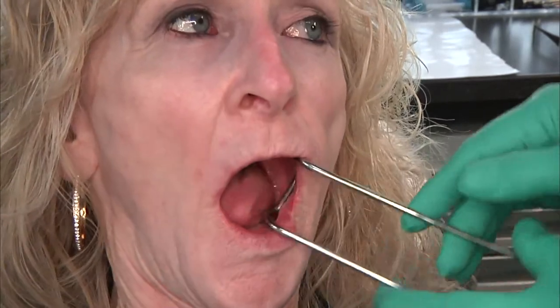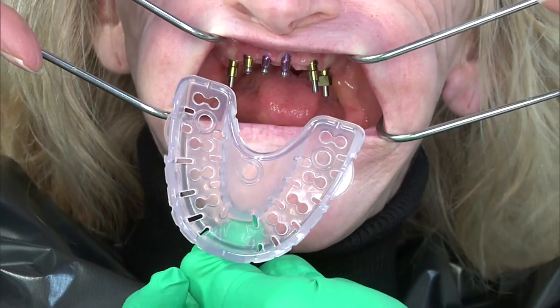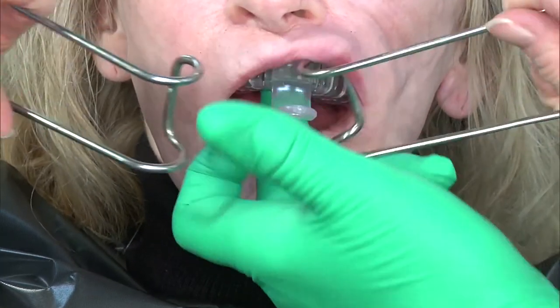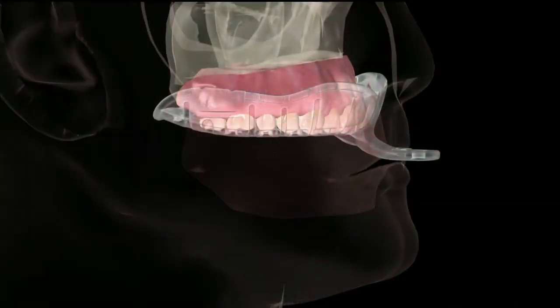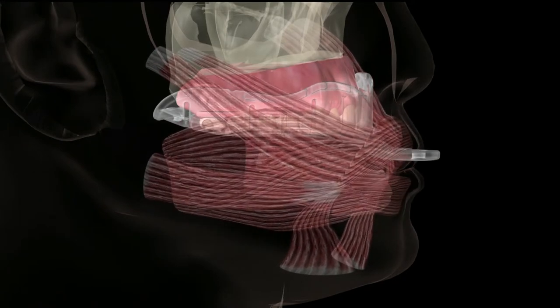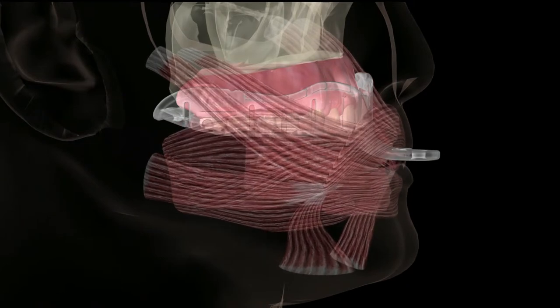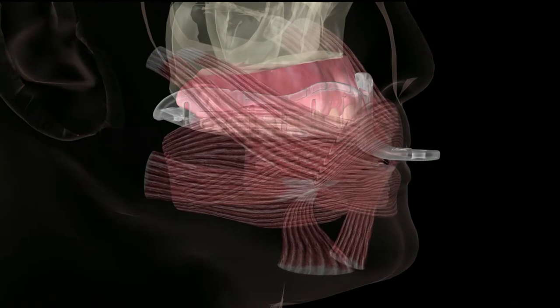Prepare your patient for the heated insertion of the tray and assure them that the heat will dissipate within 5 to 10 seconds. Quickly place the tray in the mouth using cheek retractors for accessing a quick insertion into the oral cavity. The cheek retractors are removed, and then the patient and/or operator move the facial muscles to shape the tray to conform to the optimal configuration. This shaping must be completed while the tray is rubbery for optimal intended results.